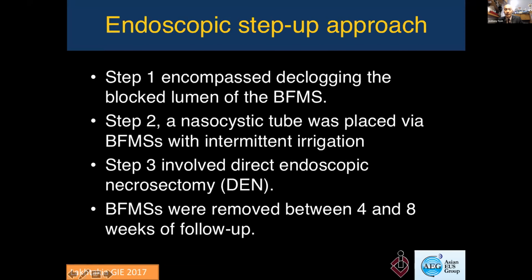So right now, most of the endoscopy units are practicing an endoscopic step-up approach. After drainage, if the patient still has persistent fever, then we would need to perform a repeat OGD, because sometimes the solid material would be obstructing the lumen of the stent. Then, if there is persistent sepsis, we will insert a nasocystic catheter, followed by necrosectomy. And in general, the stent will be removed 4 to 8 weeks after the necrotic cavity is cleared of necrotic material.